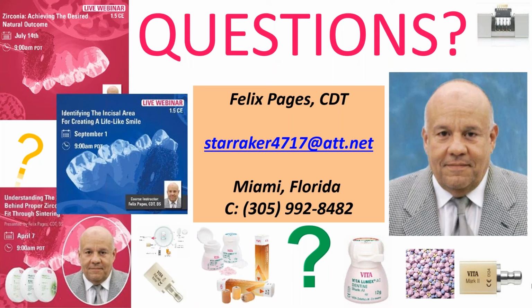He's been painting since day one because sometimes if the puck doesn't look like the tooth, there's no way you're going to match it. This way you can keep coloring it until you get the initial product, the framework, to look as close as possible to the final color. That's how we do it.